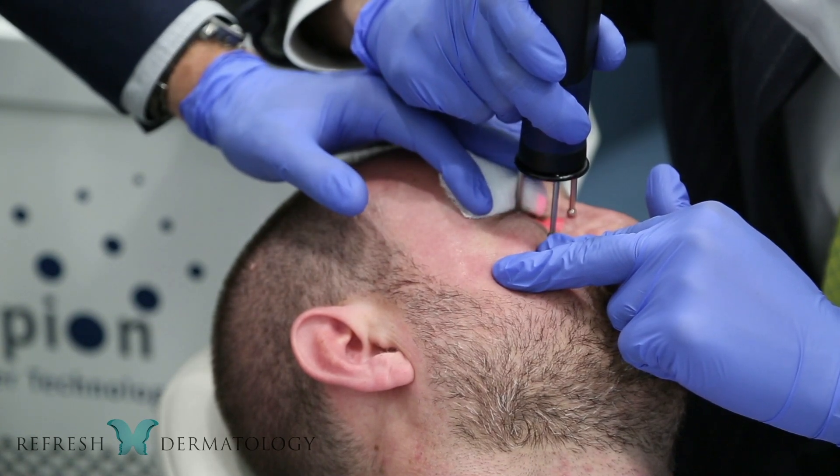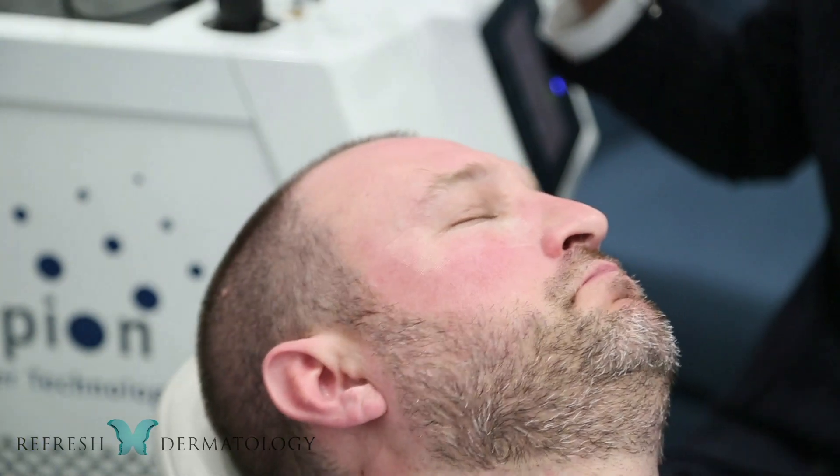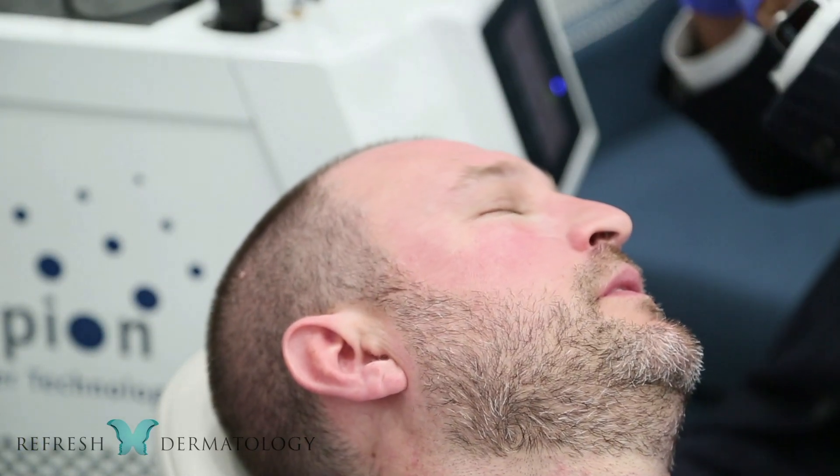It's a great treatment that the laser can do, and so my offhanded comment turned into making me a patient today.